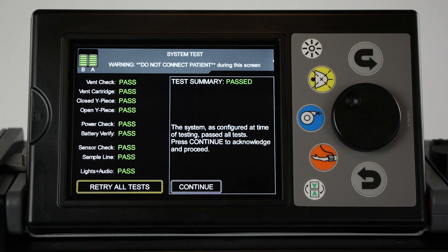If all tests are successful, a test summary is displayed, indicating that all tests have passed.